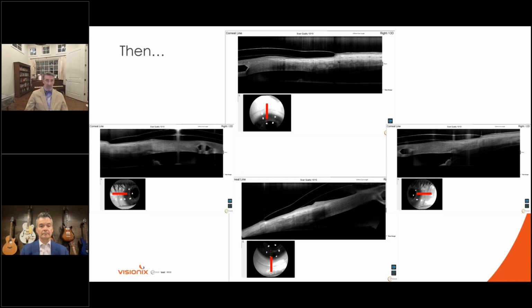But basically what the papers told us is that the closer you get to 200 microns of vault throughout the wear of this lens, the more oxygen you're going to get to the cornea. And further, in a second paper, what they showed is that if you go up to 400 microns of vault, you reduce the amount of oxygen getting to the cornea by 30%. And that's a big deal. So what that tells us is, gone are the days where you can just eyeball how much vault you have using the slit beam estimation technique. We really have to be fitting scleral lenses with precision. And really what we're shooting for is that 200 micron level of vault.